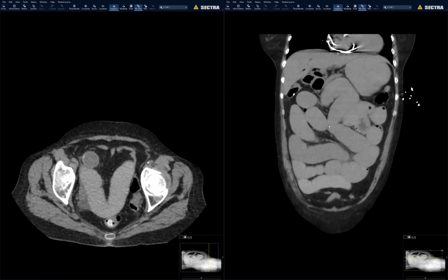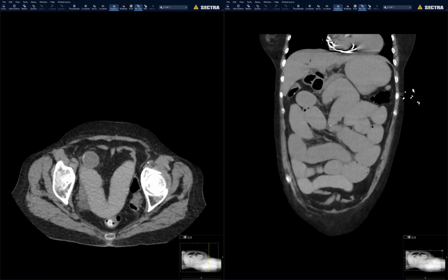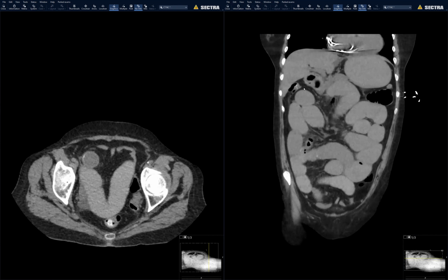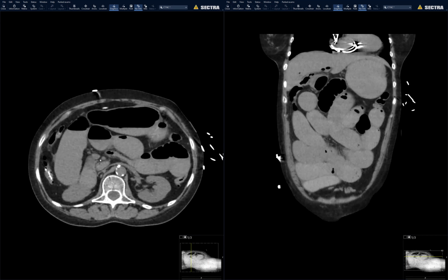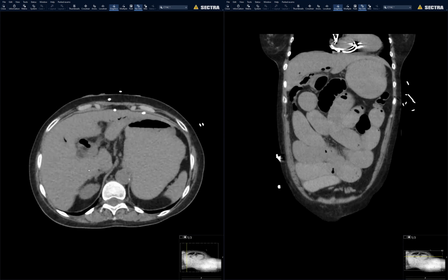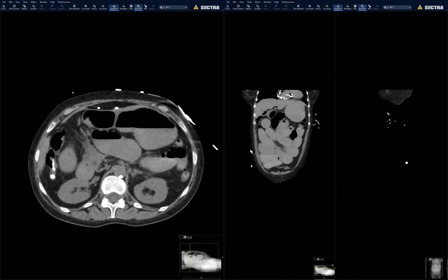Nice. And it has Rigler's triad, which is biliary air, a stone, and an obstruction. Although I think you could even see the air in the gallbladder, right? Could you see the fistula? Let me just go back. Yeah, right there, you can see air in the gallbladder. This one here. Right there. It's blending together with the bowel. It was just a very cool case.